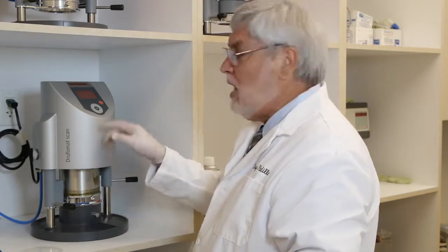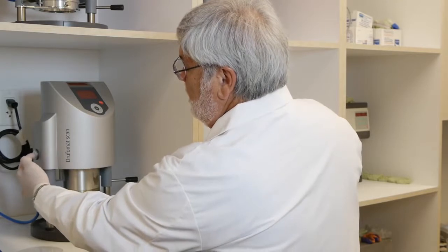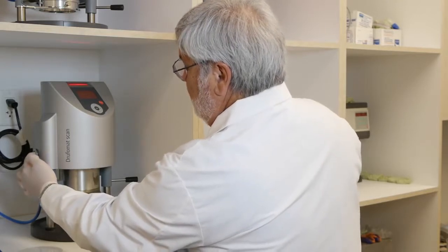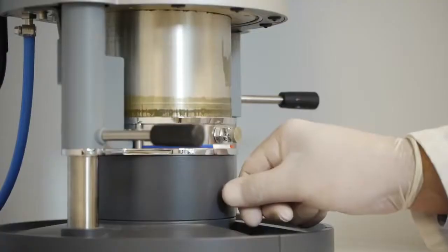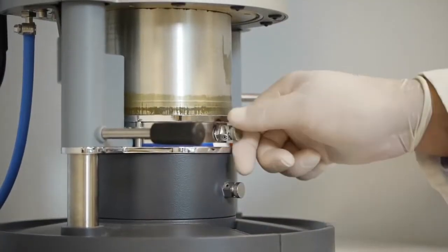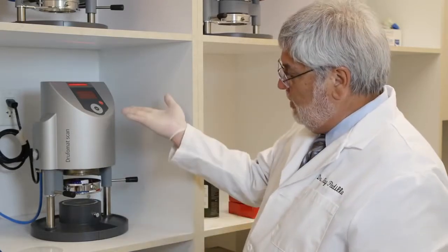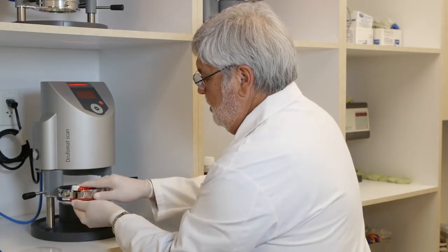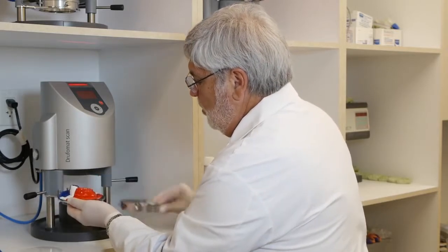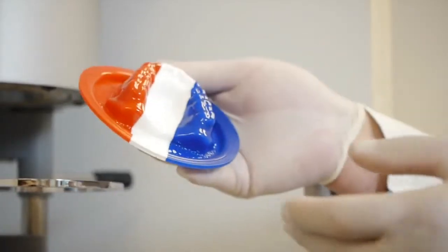There's my beep. So now I know it's cooled sufficiently. I'll press this white button. All the pressure will release. You may want to release this added pressure. Now that will rise by itself. Remove the ring. There is my first layer.